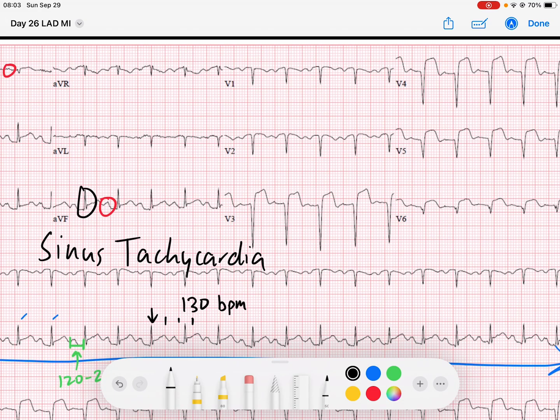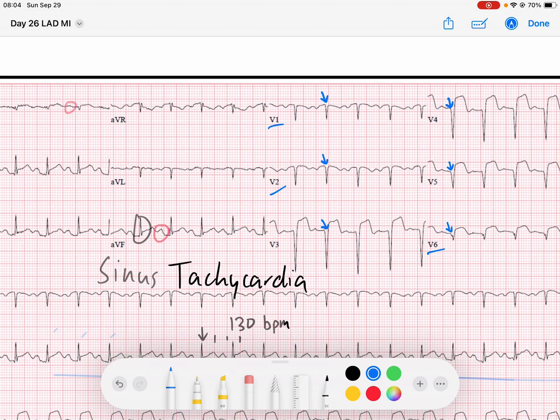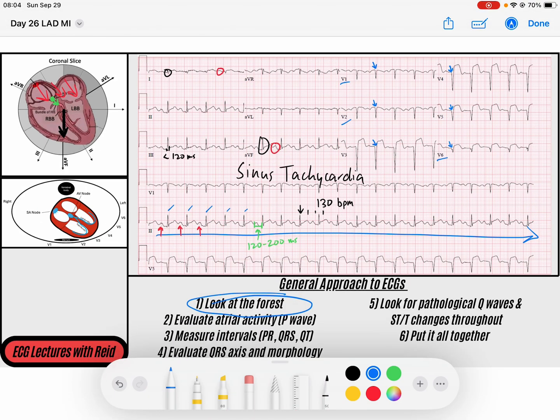I've got pretty poor R wave progression through my precordial leads V1 through V6. I don't really have much of a septal R wave. There's no R wave in V2, barely any R wave in V3, V4, V5, and V6. So not a whole lot of activation, especially around that anterior wall of the myocardium, which is a bulky area of the heart. We should see some R waves there — and I wonder why.